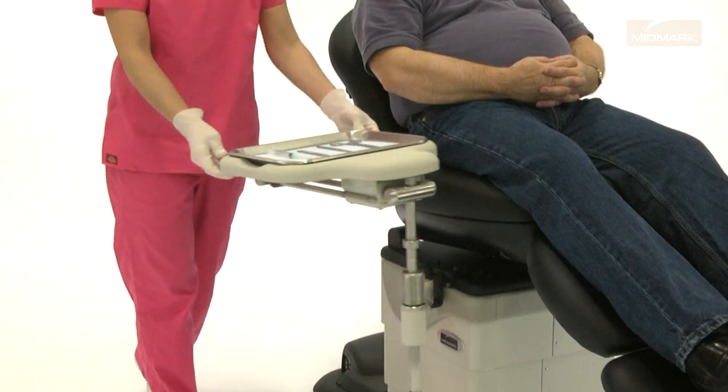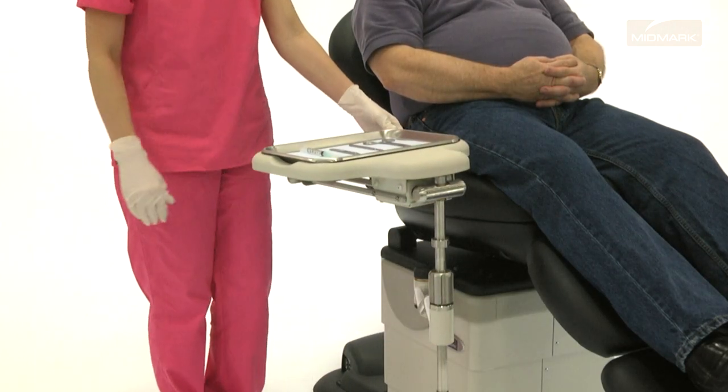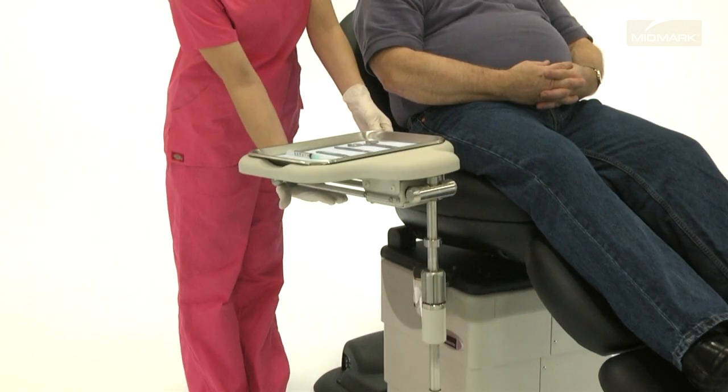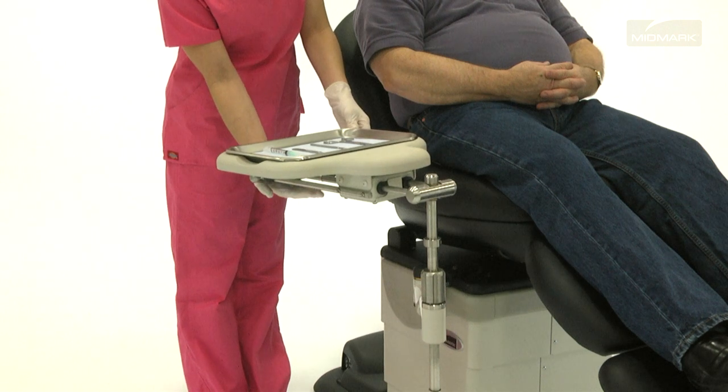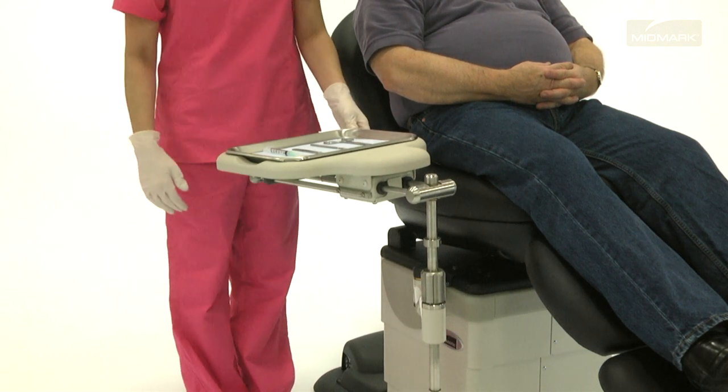In addition to height adjustment, the extension-top swingarm instrument tray includes tray movement. To adjust the sliding tray position, squeeze the tray handles, slide the tray into the desired position, and release the handles to lock in place.